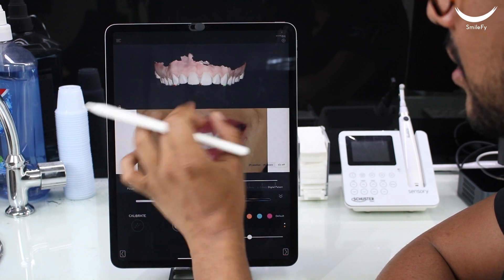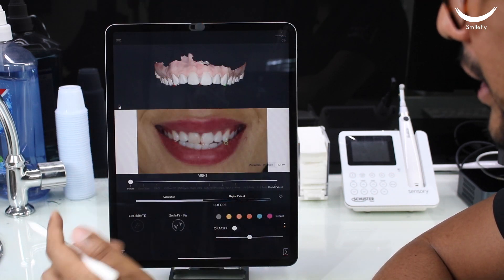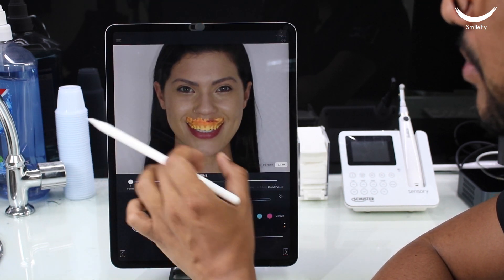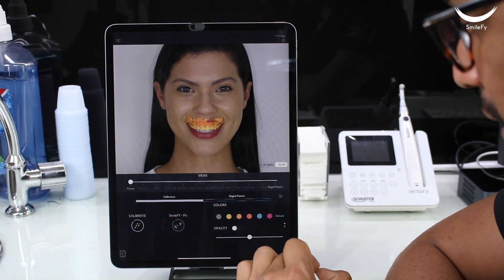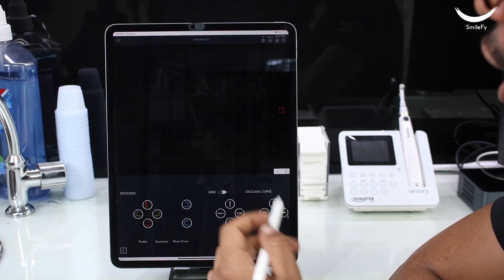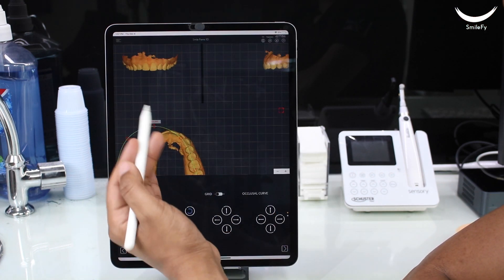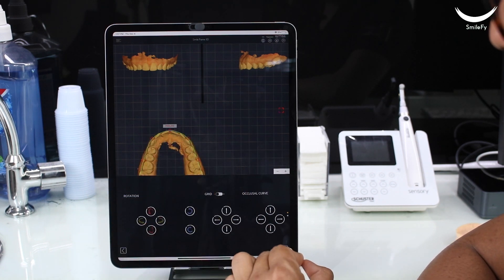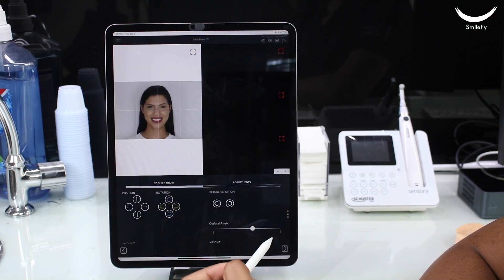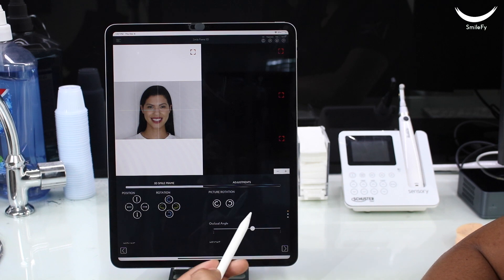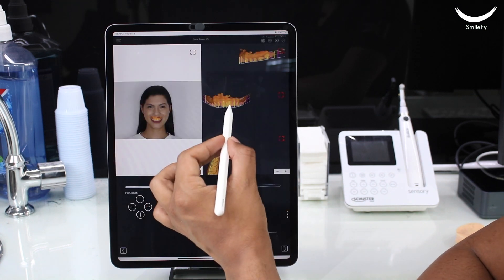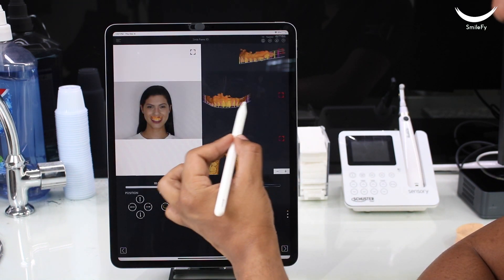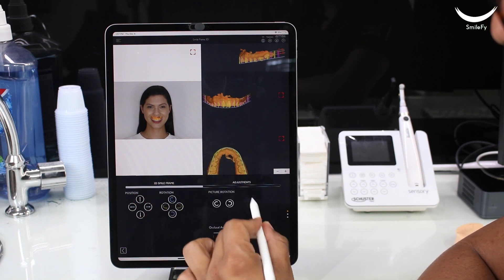With your files uploaded into the software, you will calibrate them to begin the facial-generated Smile Trial. By following the steps, you will be able to create a Smile Frame, which gives you the chance to preset the proportions and position of the future 3D design.